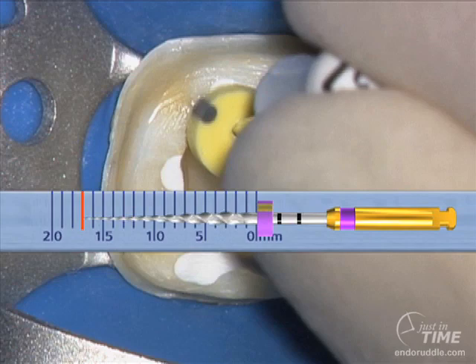It's critical that we never let the tip of the instrument run into no man's land. We never carry any given file apical to where we have a secured glide path. In this manner of sequential preparation, we always know we're inside the glide path and the rotary instrument can work safely. Recall, the tip of this instrument will do virtually no work, as most of the workload will be pushed up to the bigger, stronger, and more efficient blades.